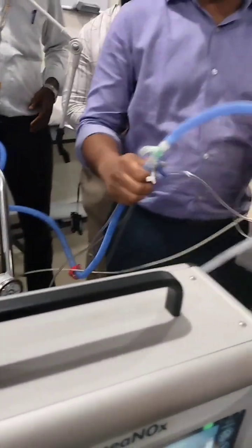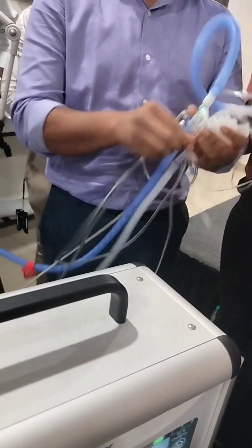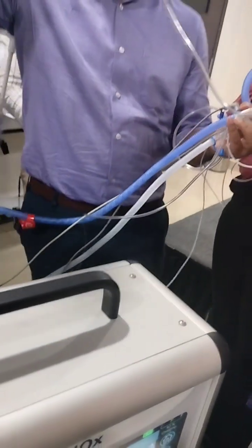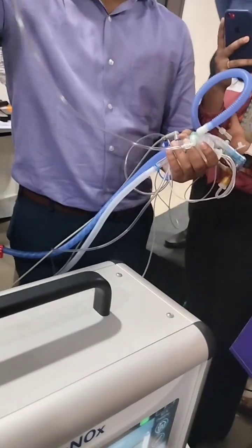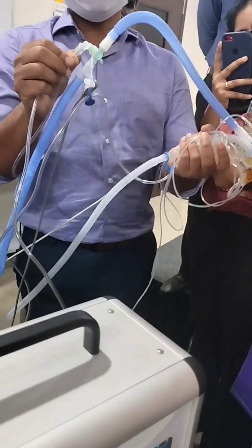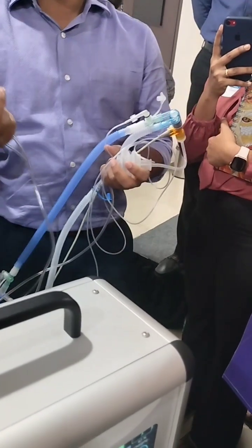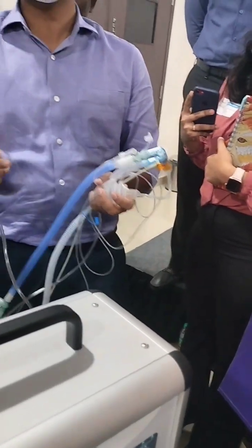This is the sensor of the humidifier chamber. So this is the iNO delivery system — from this unit it is dispensing the recommended ppm of iNO into the inspiratory circuit. From there the gas goes to the baby, and when it reacts with the baby's oxygen it will produce nitrogen dioxide.